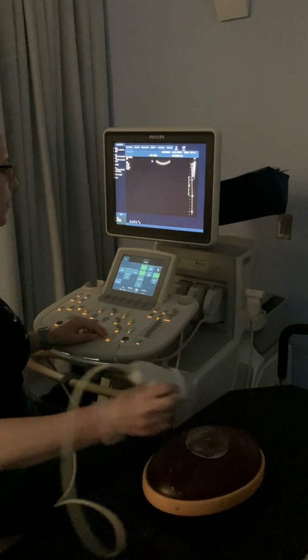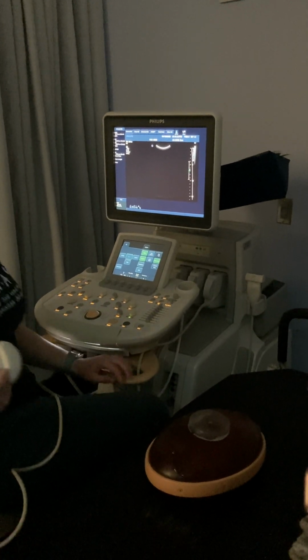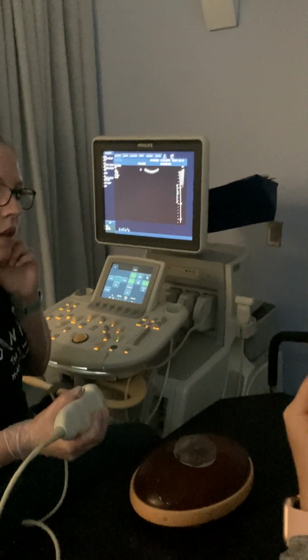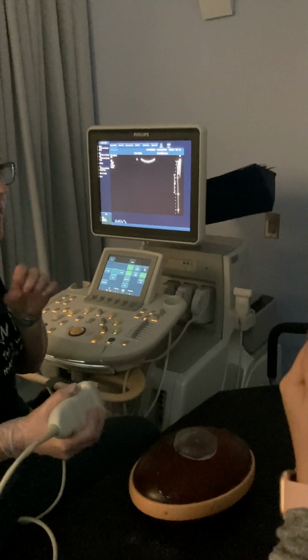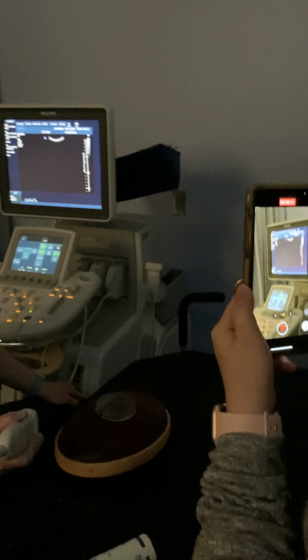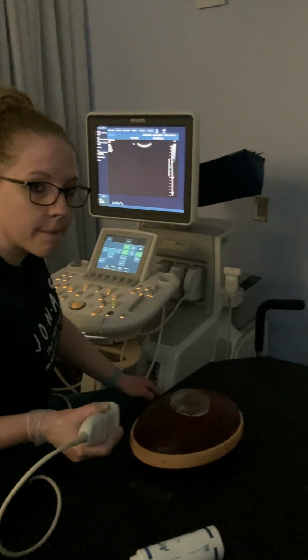Any questions for biometry? Can you show me how to see the boy? See in between the feet. Yeah. You can see the boy, right? I'll tell you that. And then what were you saying? Shay had on the list humerus length. Oh, okay.